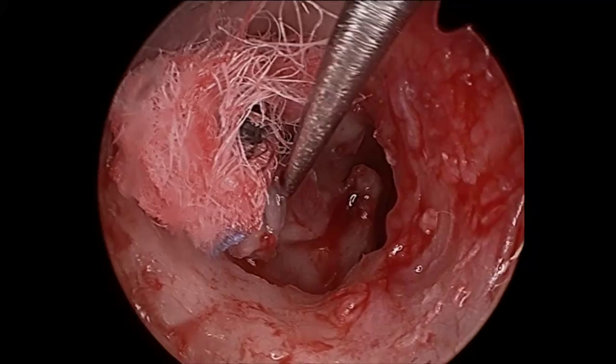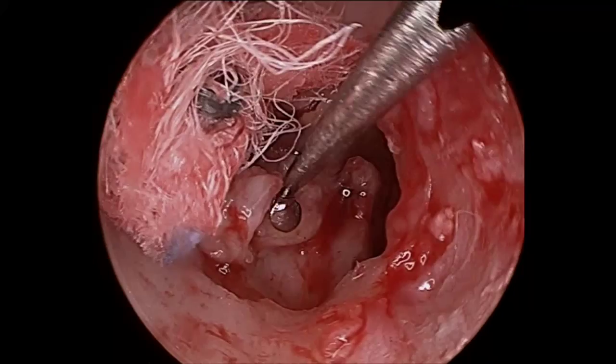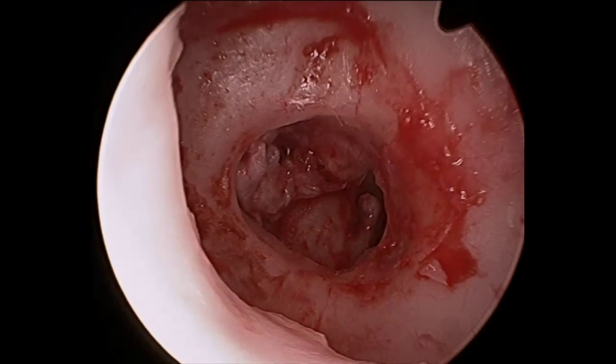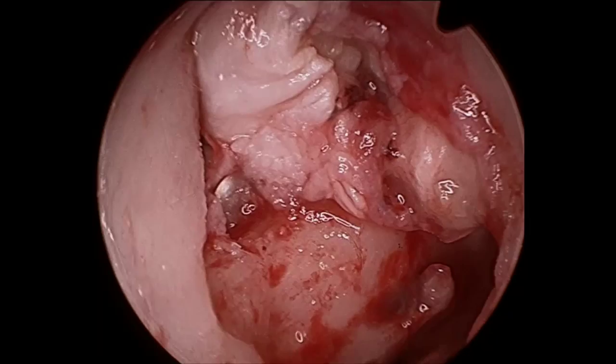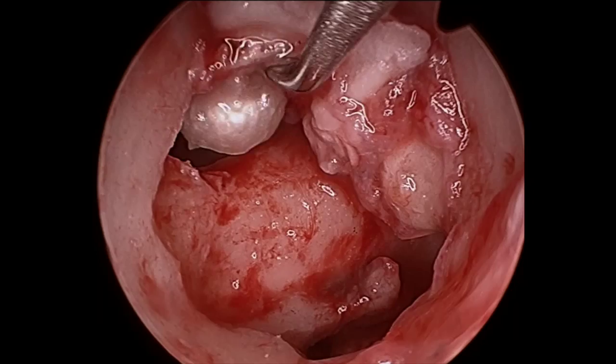The sac is then dissected off the lateral semicircular canal, which is abnormally positioned in this child who has an atretic ear. The superior aspect of the sac is then dissected, and a thirty-degree scope is used to remove a second pearl that is extending into the antrum and above the superior semicircular canal.